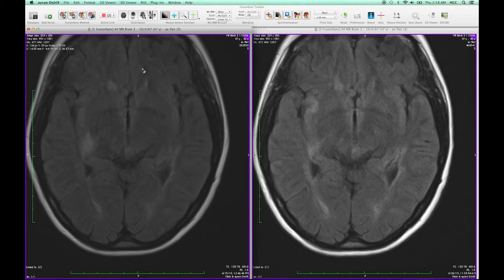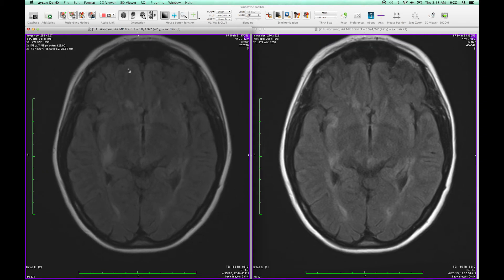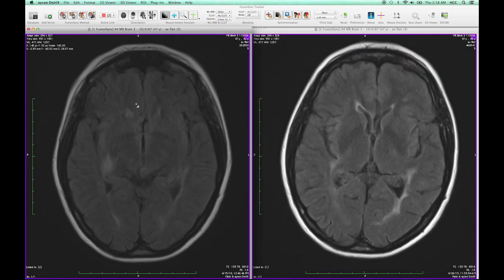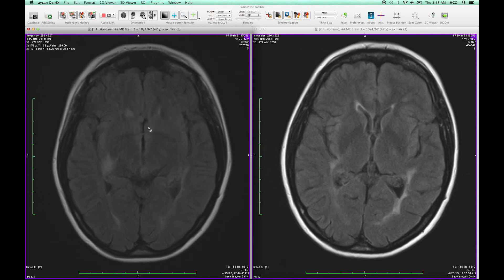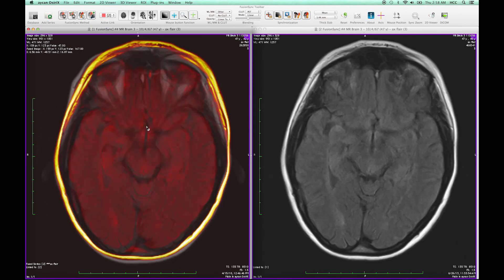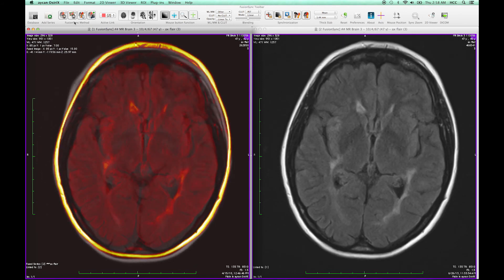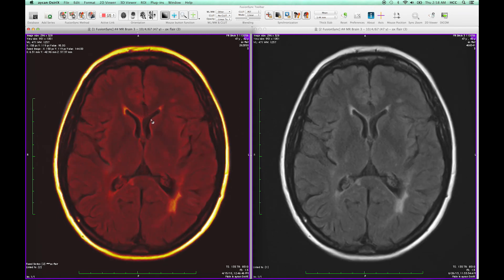I will just show you the difference between the original image position as given by the DICOM coordinates that are used by the 2D viewer and when applying the rigid registration. Let's switch to the DICOM coordinates. You can see this quite easily by applying the overlay visualization, which is accessible via the context menu by clicking the right mouse button in the FusionSync menu and enabling blend. Now this is how the positions originally were according to the DICOM coordinates, and this is where the automatic registration compensates for the translations and rotations.